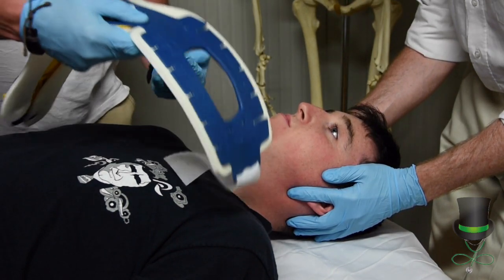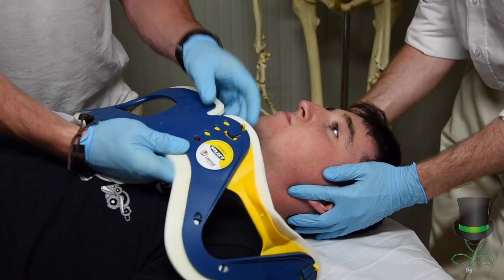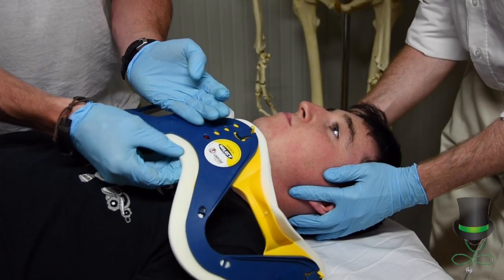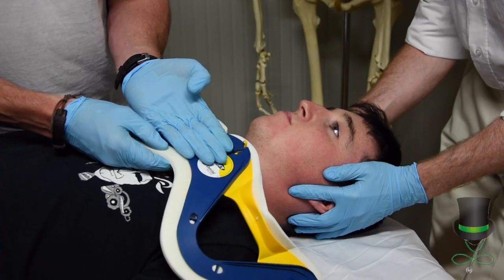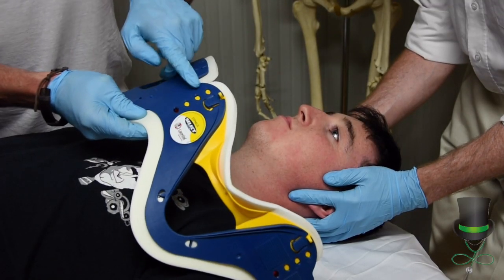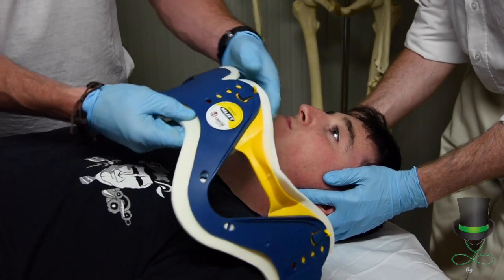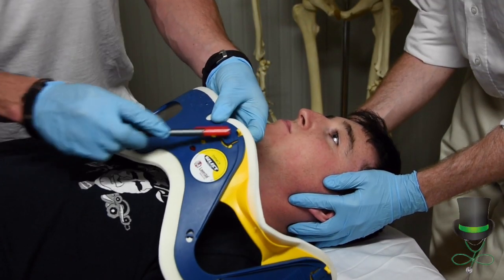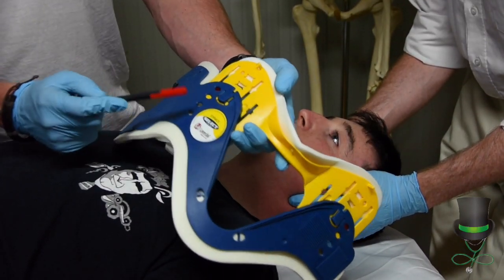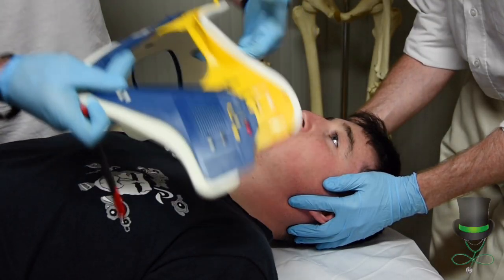We get our collar and form the collar. We then measure on the side of the collar four fingers from the plastic edge — not the foam. Four fingers from the plastic edge brings us up to the top notch here. We ensure that the pins are disengaged and move our red dot up to the top, then lock our pins in place like so.